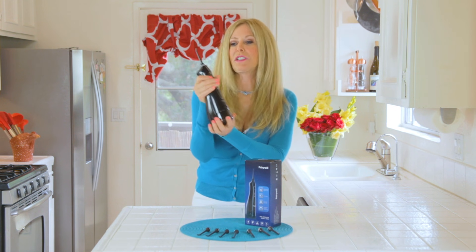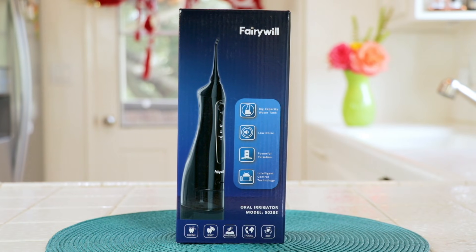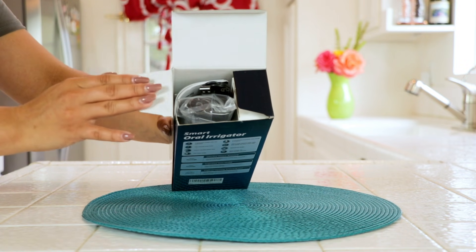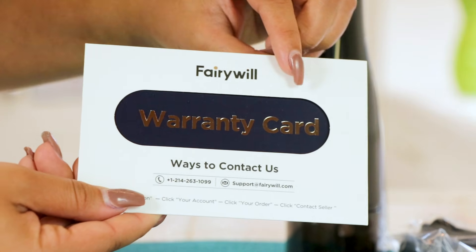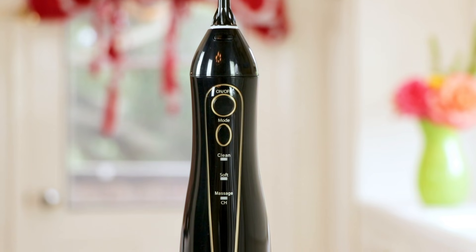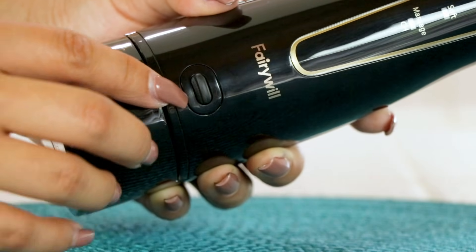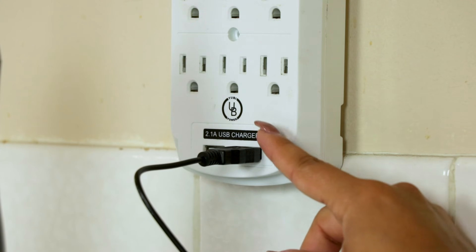The sleek design is really terrific for holding. The Fairywill smart oral irrigator came right to my house in a really pretty box. It was packed really well. It came with a manual and a warranty. There is the oral irrigator with the tank and also eight nozzles.